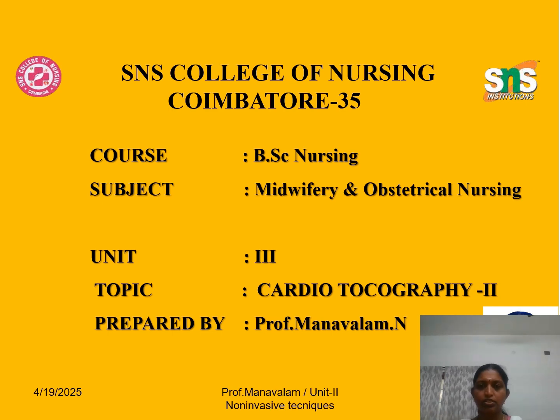This is a series of cardiotocography we are going to see in this video. Already we have seen the introductory sessions about the cardiotocography in cardiotocography part 1. Now we are going to see about the cardiotocography part 2.